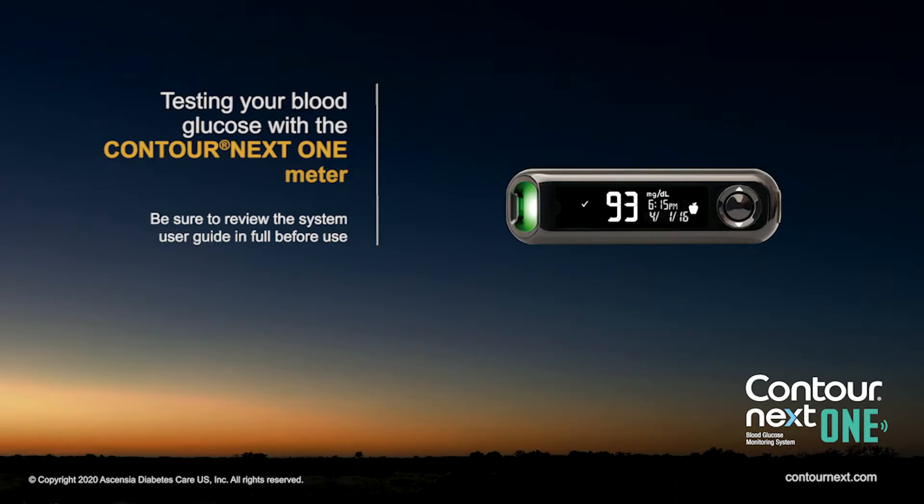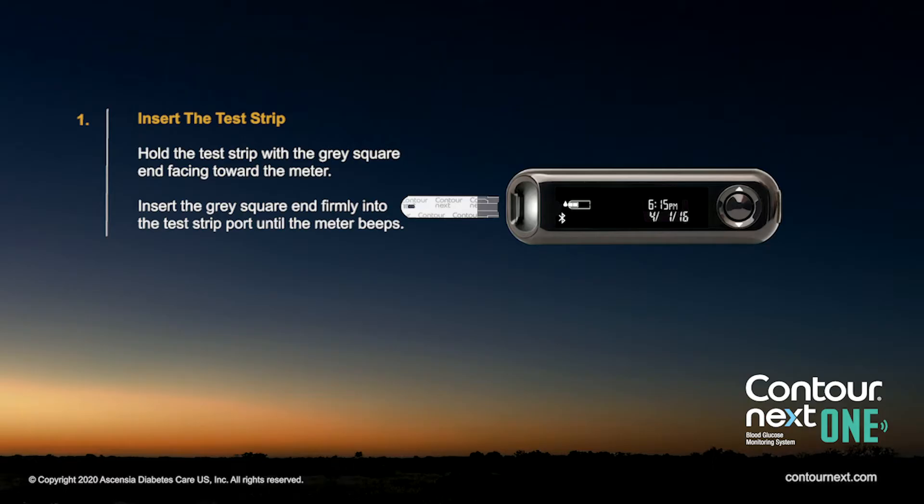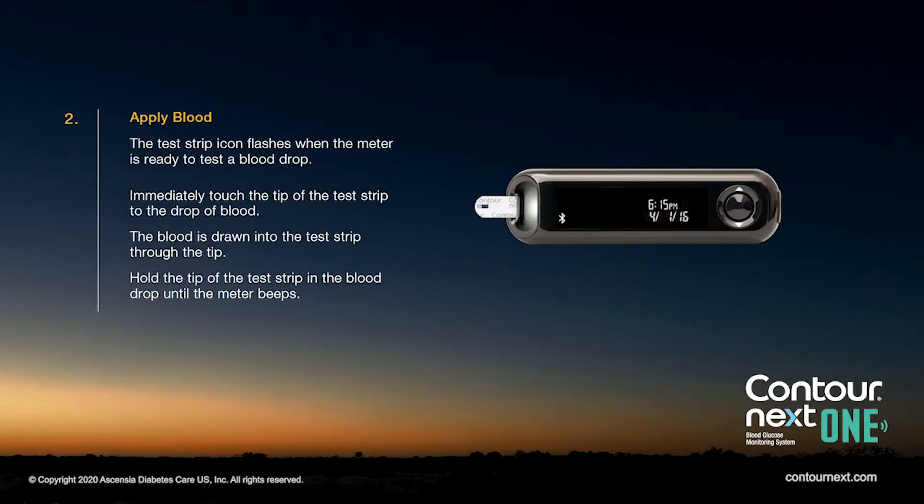Testing your blood glucose with the Contour Next One meter. Be sure to review the system user guide in full before use. Hold the test strip with the grey square end facing toward the meter. Insert the grey square end firmly into the test strip port until the meter beeps.